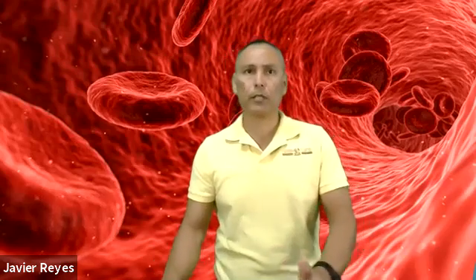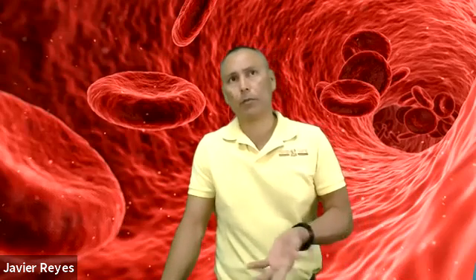All right. Now, using wrong or expired collection tubes. Obviously, this is very easy to determine. You should never be using wrong or expired collection tubes because, number one, they will have less vacuum. You will not be collecting enough specimen. And using the wrong tube for the wrong test, obviously, is going to be rejected. So be very, very aware of that.